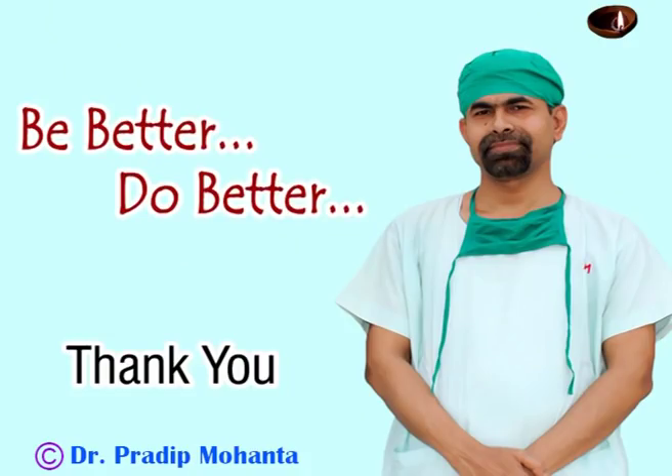Thank you very much for your attention. Hope this video will help you in developing your surgical skills. The key in this video is to see in which direction the rhexis should go. In this case, I had to move the tag clockwise to make the rhexis. Thank you once again for your attention.